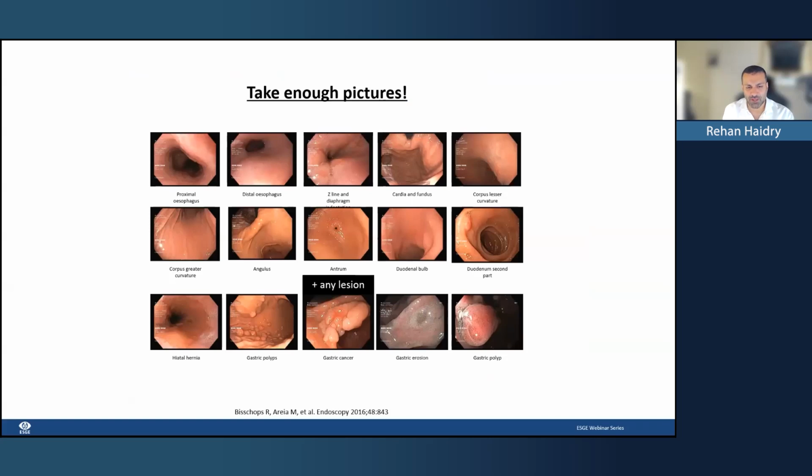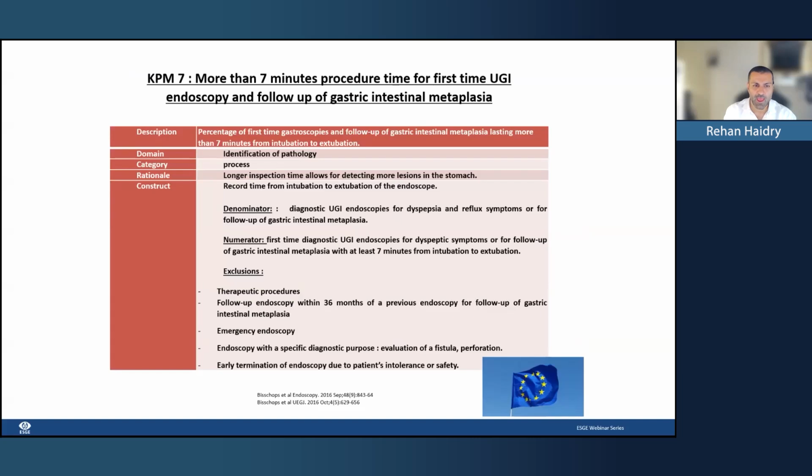So take enough pictures. Professor Bisschops has published on this before, and this is really, really important for when patients come back for follow-up and are scoped by endoscopists who may not be the same, but also for retrospective learning and audit. Now, we spend a lot of time talking about how long we should take looking at the colon.